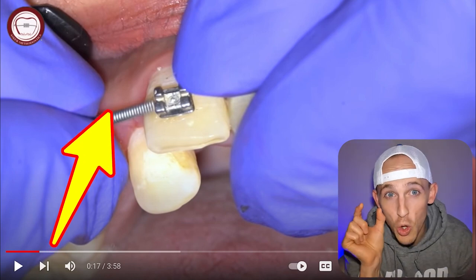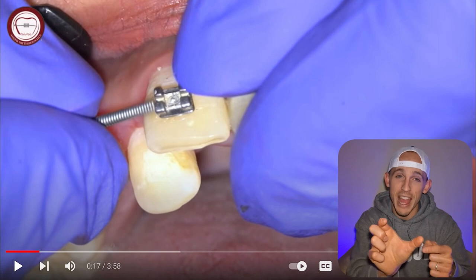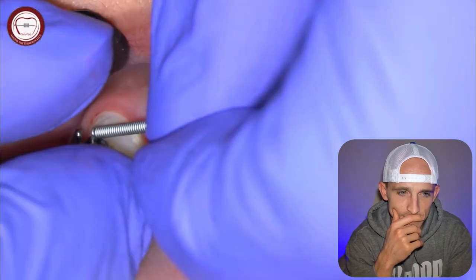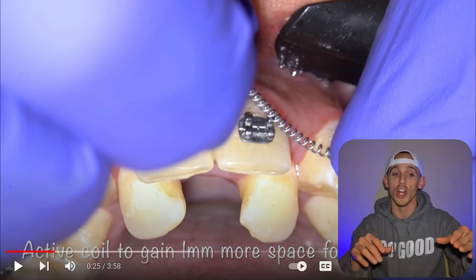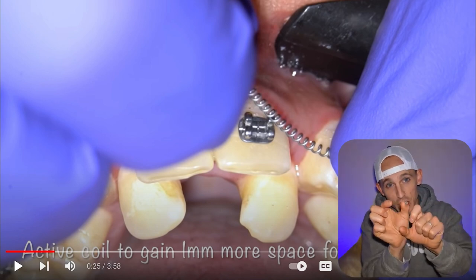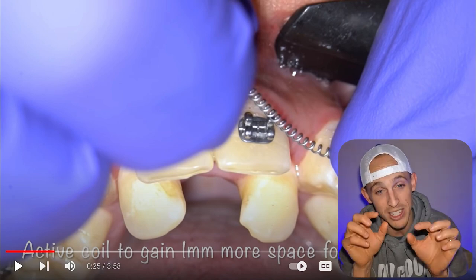That thing right there is called a closed coil. A closed coil doesn't have space in between the individual links or springs — it's looped around but there's no space in it. The purpose of that is to just hold the space. It's called a closed coil because it's closed — there are no gaps in between each of the links. An open coil, on the other hand, has space in between each of those coils or links. They're trying to activate it, meaning they're going to spread it out further than the space between these two teeth, compress it down, and then when it relaxes and opens back up, it pushes the teeth apart. Sounds like this doctor feels they need a little bit more space on this side to match the other side.